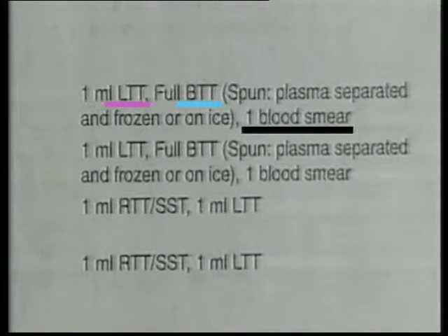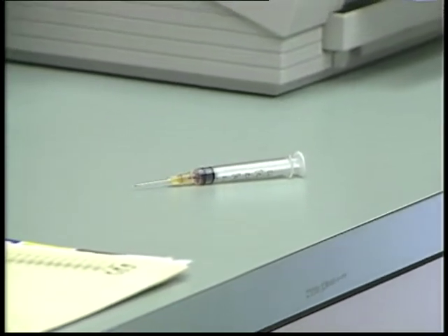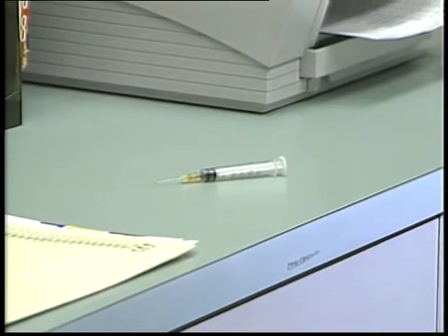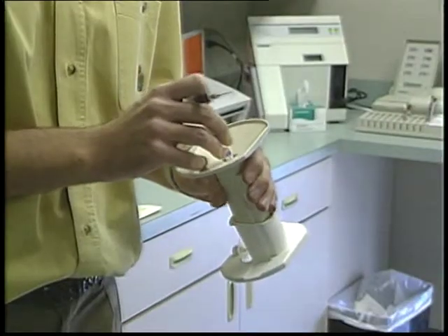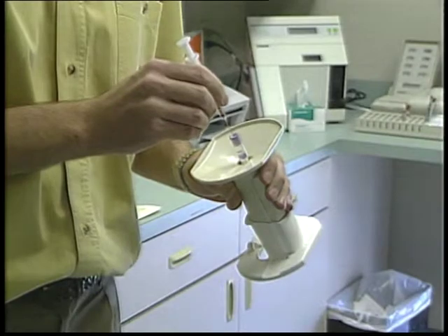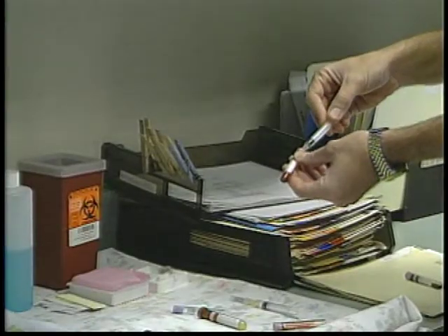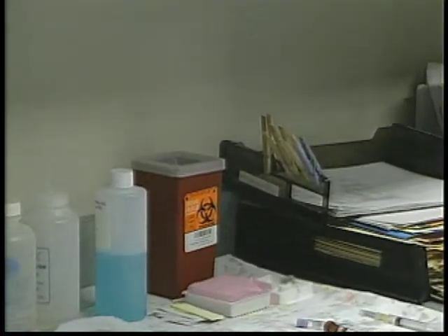It should be emphasized here that utmost safety should be practiced when dealing with uncapped syringes and potentially infectious blood. Always be careful not to inadvertently stick yourself while handling a sharp needle. Special safety holders have been developed to reduce the risk of sticking yourself while inserting the syringe and needle into the vacutainer. You should always immediately dispose of the needle into a sharps container once the blood has been transferred.